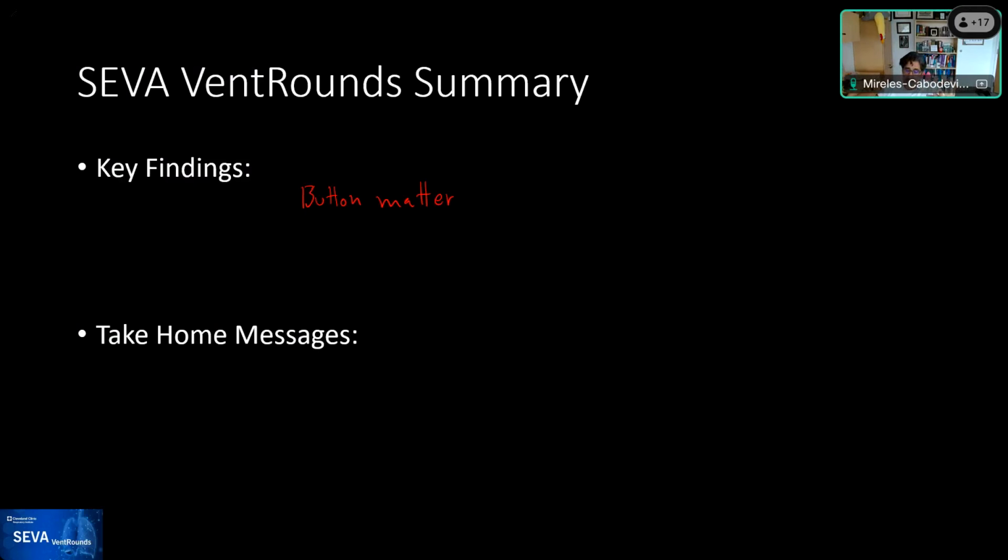This patient in particular has severe COPD. I took these just before coming in today to give this lecture, in one of our active patients. The patient is waking up from a very high level of sedation. He was essentially placed on it because of the level of obstruction the patient has, and ended up on 3 medications for sedation: Versed, propofol, and fentanyl.